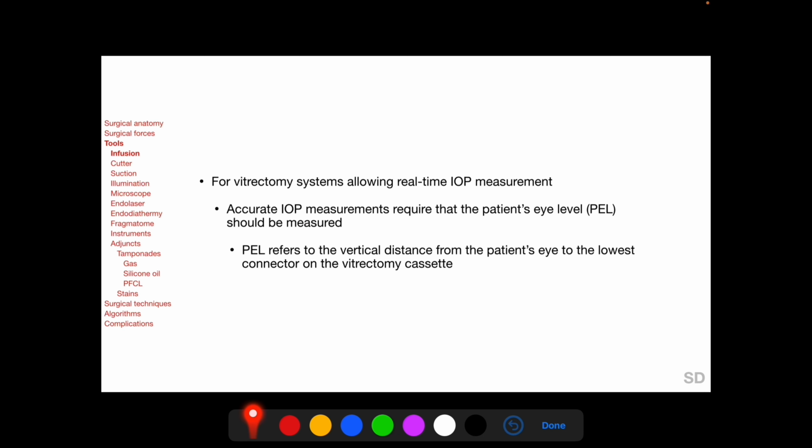Before injection, pure gas may be mixed with air in a specific concentration depending on the type of gas, so that the intraocular bubble does not expand following injection, and this is called a non-expansile gas-air mixture. A non-expansile gas-air mixture helps in more complete filling of the vitreous cavity at the end of surgery, with reduced risk of raised intraocular pressure post-operatively.